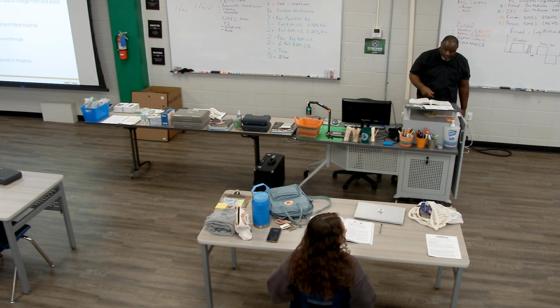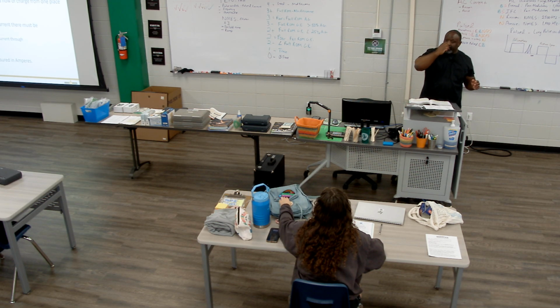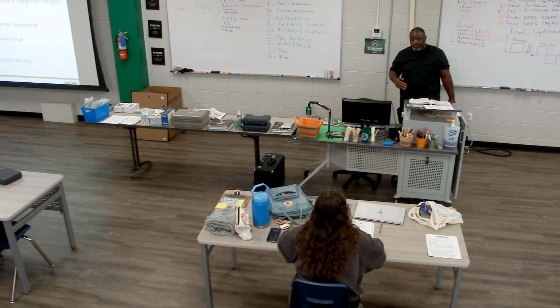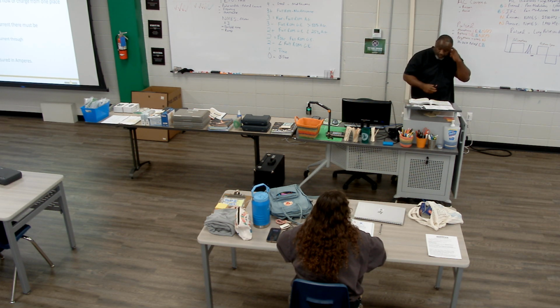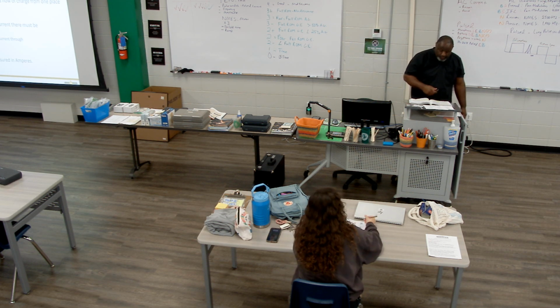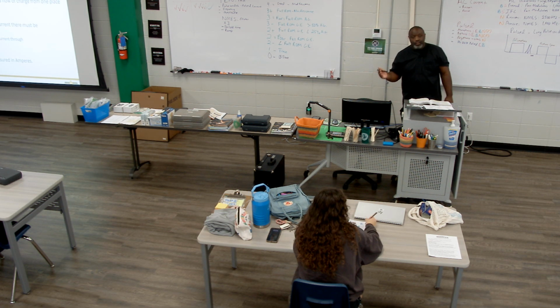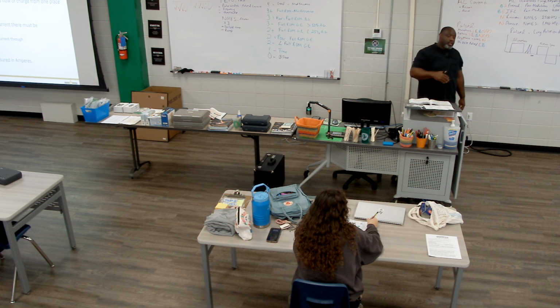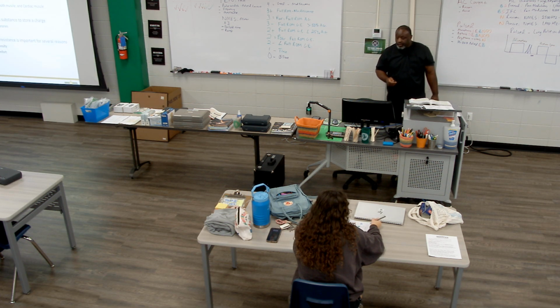It says in therapeutic E-stim, a charge transfer occurs between the biological tissue and the electrode interface. So remember we said E-stim is the flow of charged particles to an area to perform an activity. So we're flowing charged particles. Electron flow converts to ionic flow within the body. So the flow of electrons, which is electrical energy, once it's used via direct current, is going to have ion characteristics underneath the skin. So it's going to be different underneath the skin.